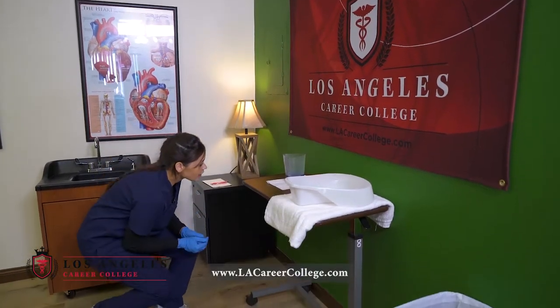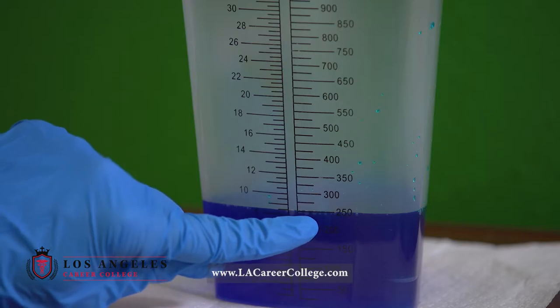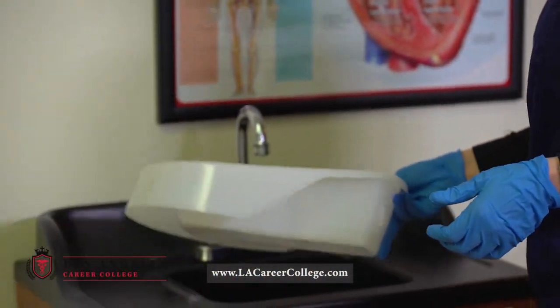Then I will get down at eye level and check my measurement, making sure to only measure in cc's or ml's.